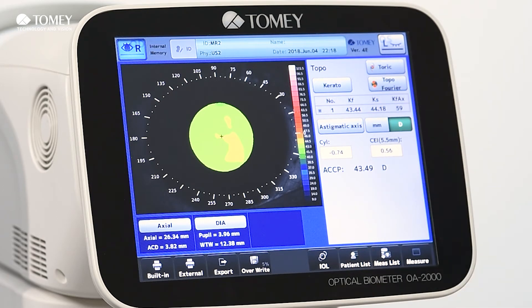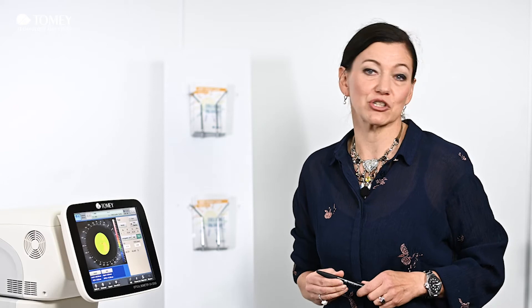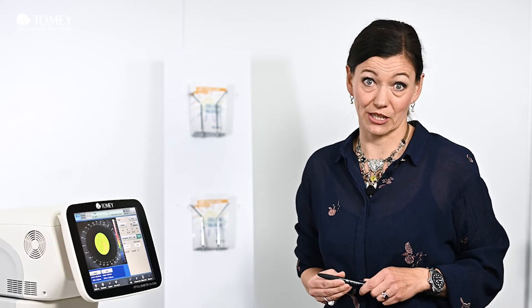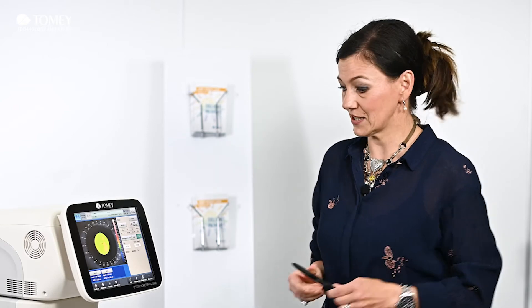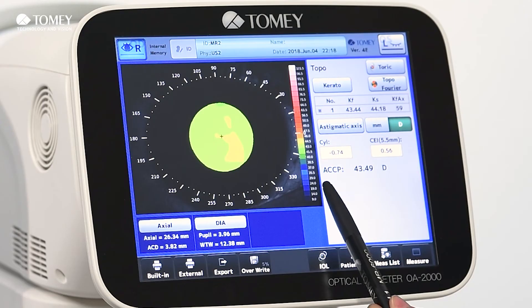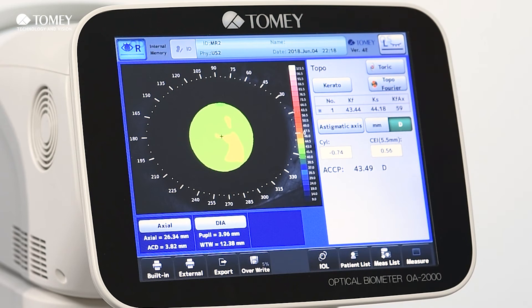Next to it you will find the eccentricity value, which is displayed at 5.5 millimeters. In some formulas only the average central corneal power is needed, which is why we have displayed it here as well.